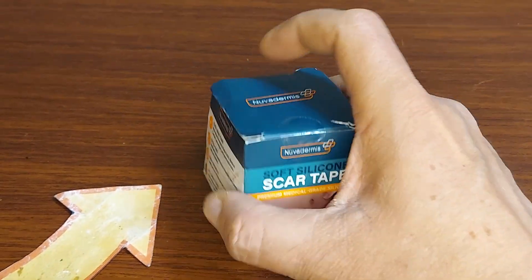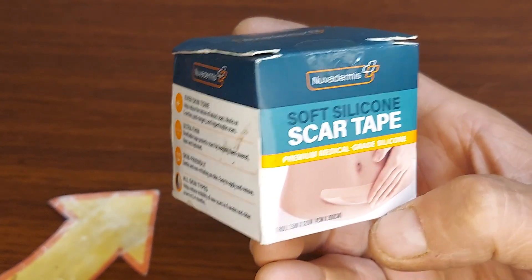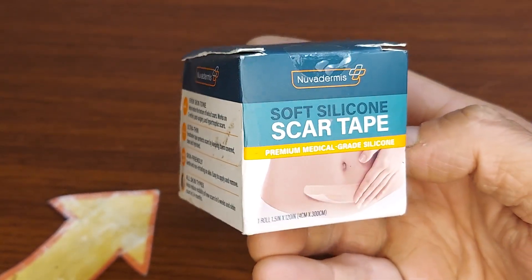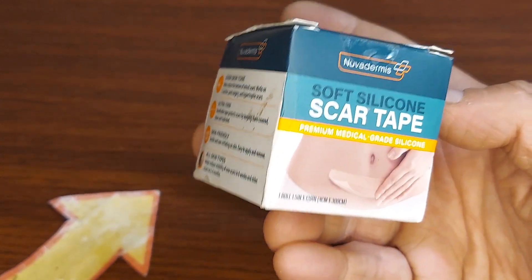Taking a look at this soft silicone scar tape — very popular, very effective when you've got a scar from an injury, from a surgery, or from other reasons.